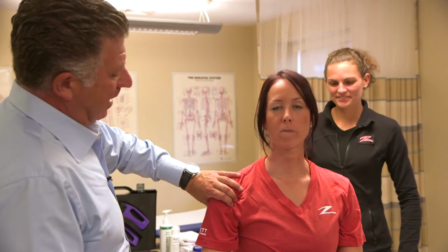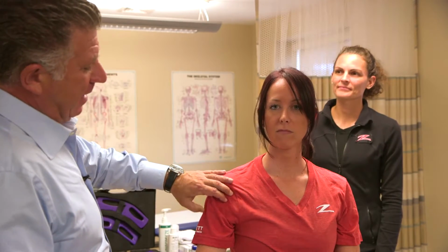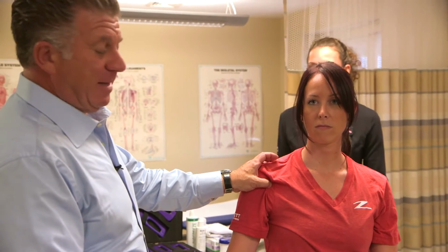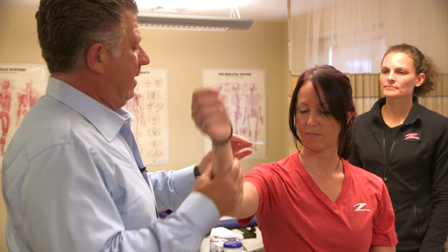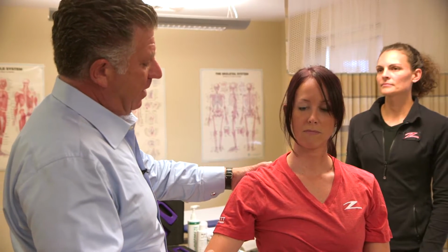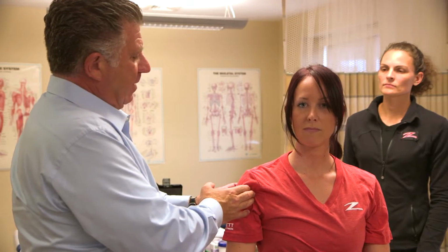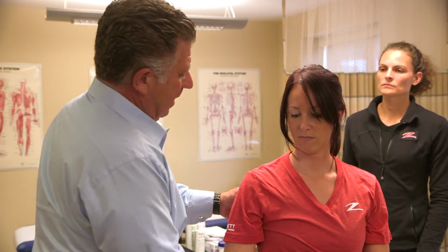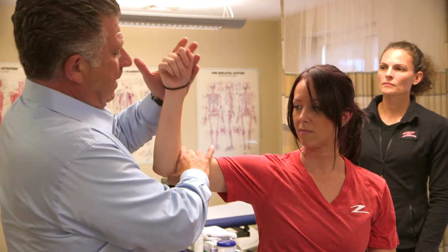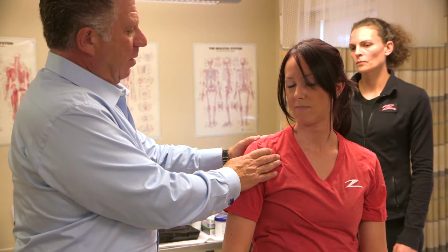We have a CrossFit client here who overdid things during her workout with the right shoulder and developed a bicep tendonitis, which she has a bit of shoulder restriction, shoulder range of motion restriction, pain, and a lot of tenderness from palpation. She also has quite a bit of weakness in the shoulder. Hold this up for me, please. Yeah, okay, so the rotator cuff muscle bellies here are also quite congested.